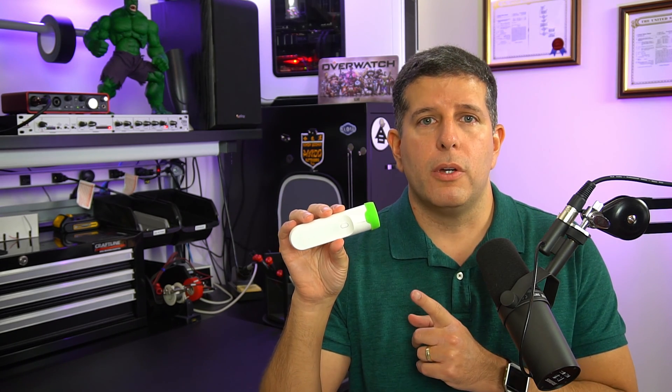Remember the medical scanner used by Dr. McCoy in Star Trek that he would wave over his patients to check their vitals? Well, we're not quite there yet, but Withings has taken a step in that direction with the release of the Thermo temporal thermometer. This Wi-Fi connected device can take your temperature in two seconds flat without even touching your skin. It's a cool piece of tech, and in this video we're going to take a closer look at it.